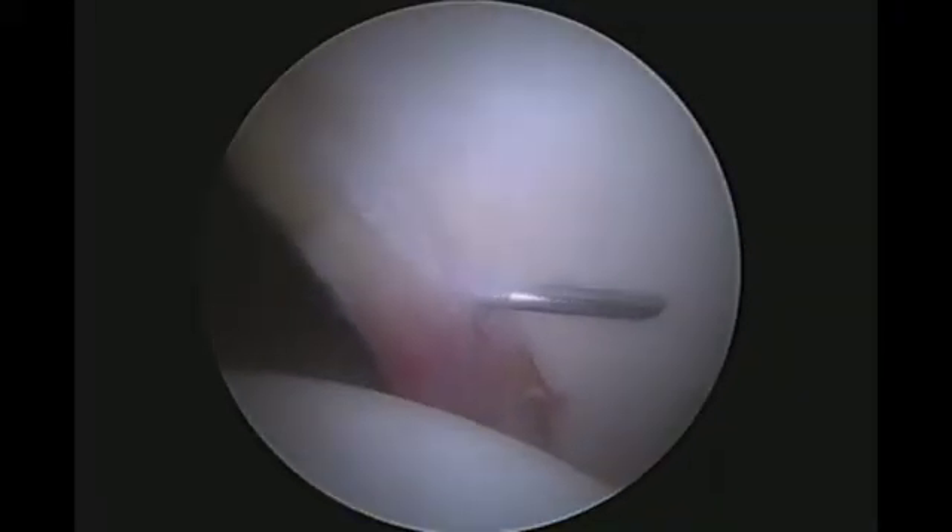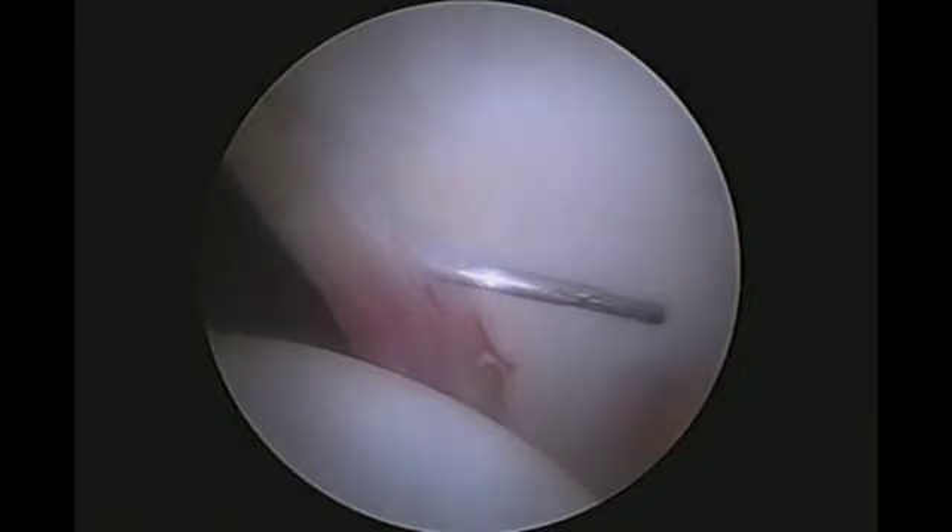A curved spinal needle is used for this procedure. The needle is curved upward to palpate the acetabulum, then turned 180 degrees, penetrating the labrum-chondral junction. The nitinol guide wire is then slid down the needle. Although the needle is curved, the wire should pass easily.